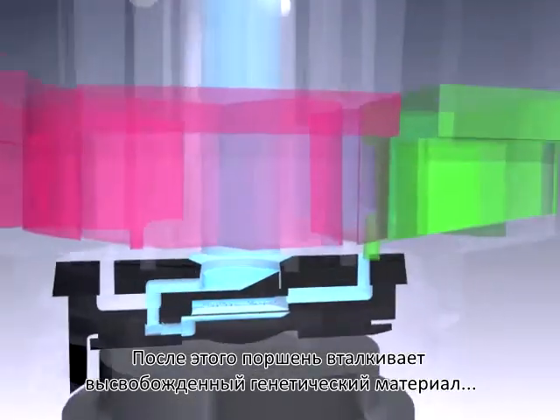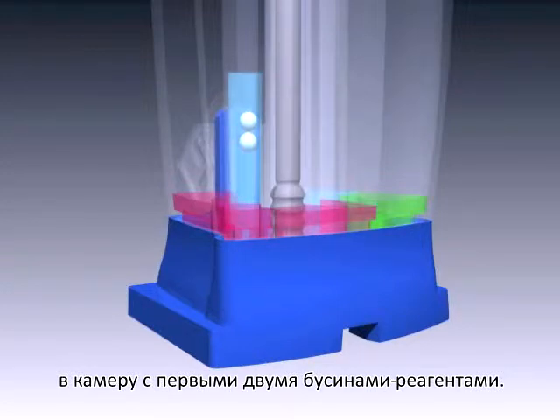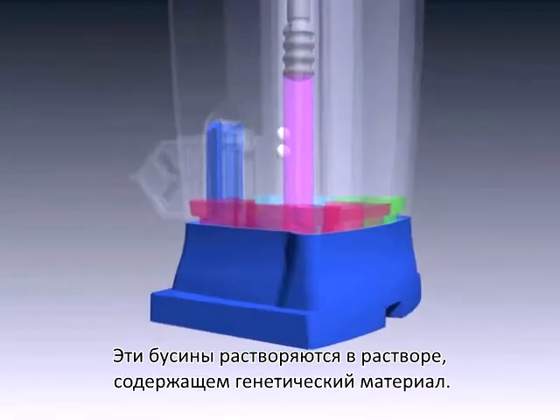Once the sonication is complete, the piston will push the liberated genetic material into the chamber that contains the first two reaction beads. These beads dissolve into solution with the genetic material.